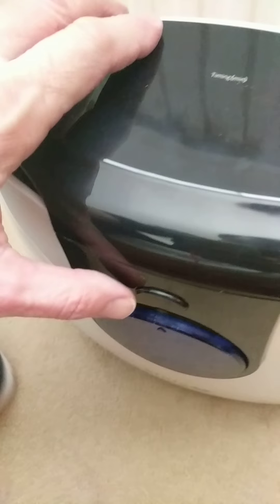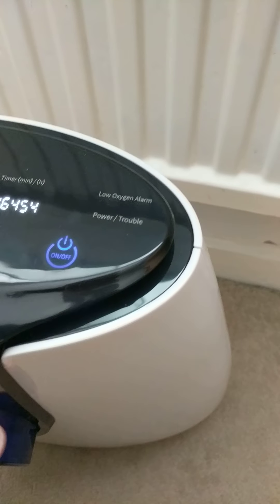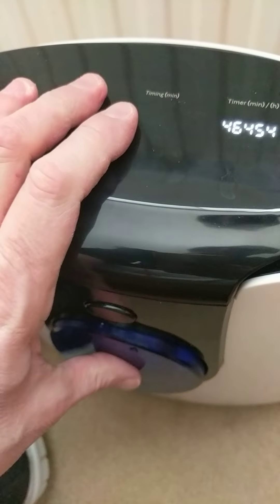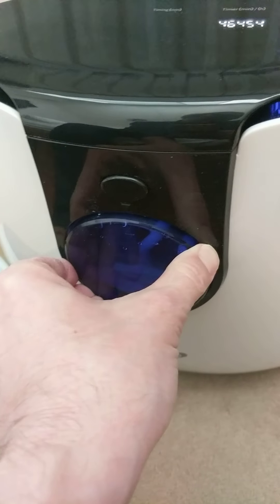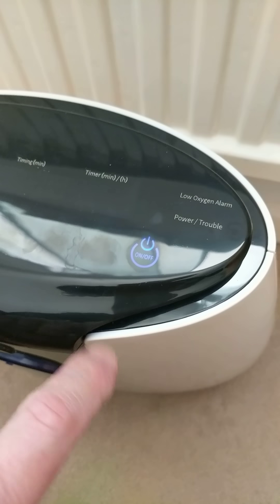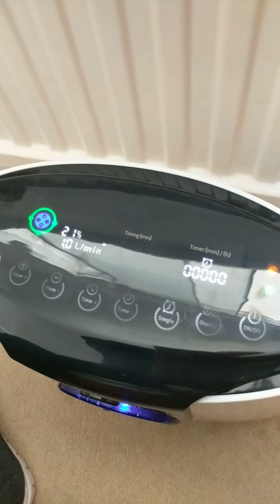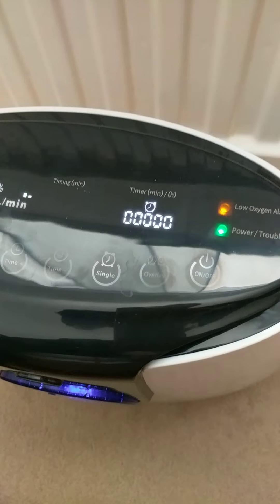We've got an error message, so I have to play with the tank again — it's fallen out. Put it back in. Extremely annoying, this tank — this is probably the worst thing about it. Maybe this will work now. There we go. Maybe it's my technique or something, but for some reason getting that tank to work correctly is a pain.